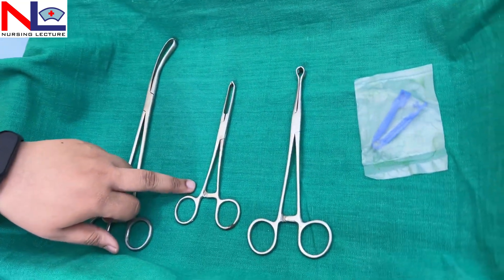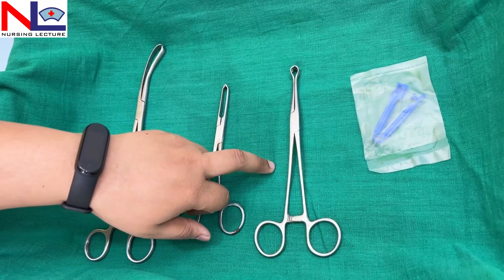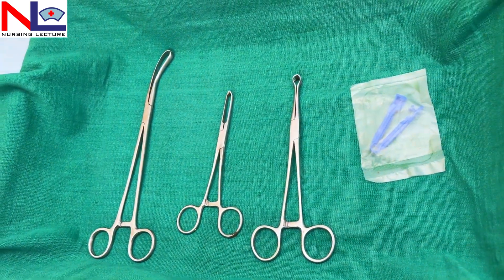In this lecture we have discussed the vulsellum, Allis tissue forcep, Babcock, and the disposable umbilical cord clamp. In the next Part 4 we'll discuss some other instruments used in obstetrics and gynecological procedures. Thank you.